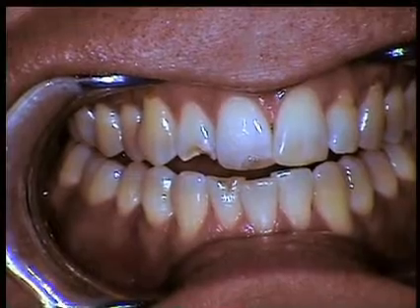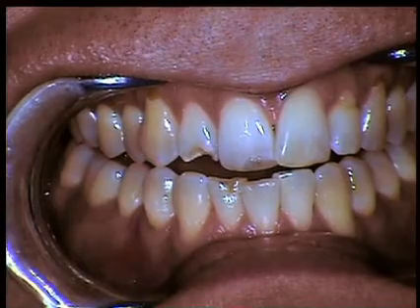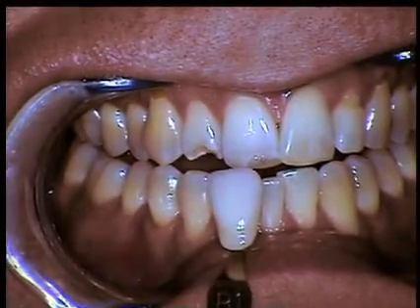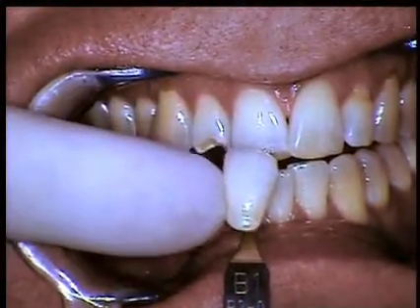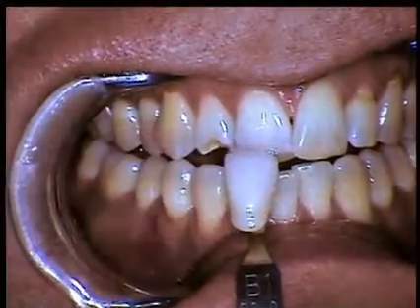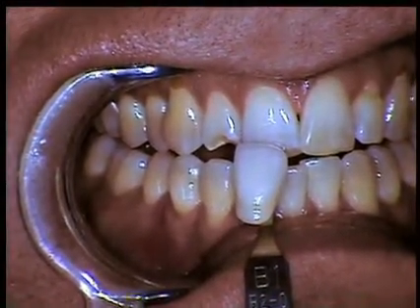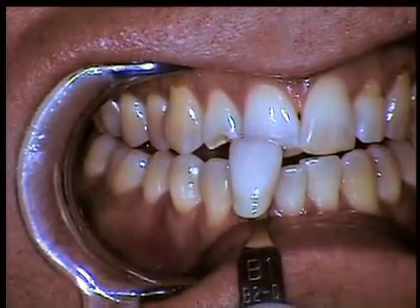The first thing I'm going to do is look for a color that matches the general body shade using the aesthetic shade guide. As you can see, the general body of the tooth is getting pretty close to a B1 shade, maybe a little bit lower in value — so a mixture of B1 and A1 is what we want to look at.